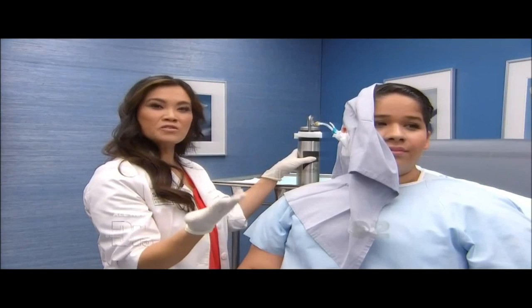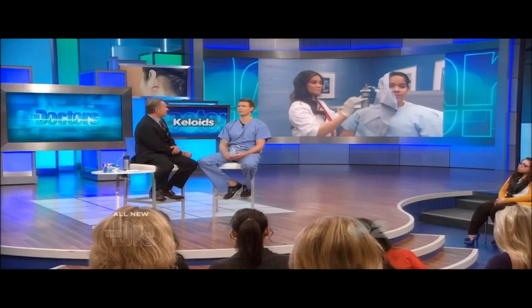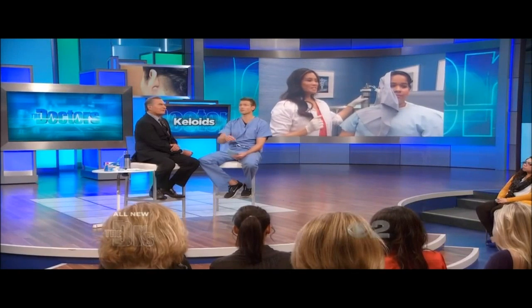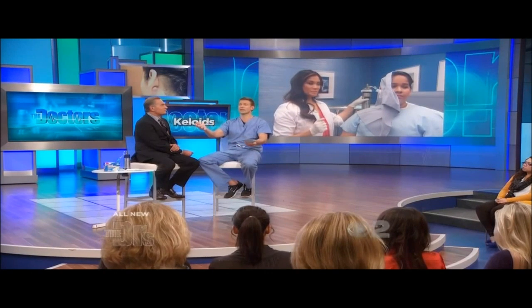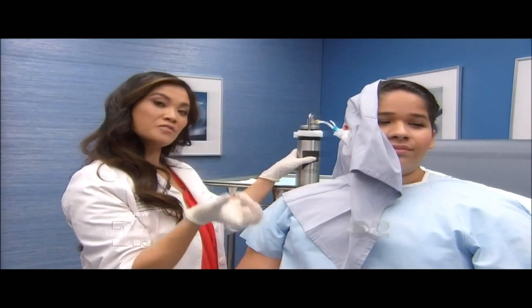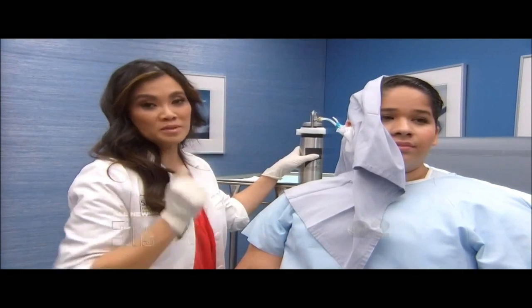So as we know, they're very stubborn. They can be difficult to treat. And this may be a terrible analogy, but much like someone who's had frostbite, their fingers won't come off right away. But if they've had severe frostbite, eventually that part that was frostbitten falls off. So will the keloid eventually just fall off? Yeah, what usually happens is either it'll turn black and kind of fall off over the next couple weeks, or it will shrivel up from a grape to a raisin. And like I said, just one treatment. I mean, how fabulous is that?